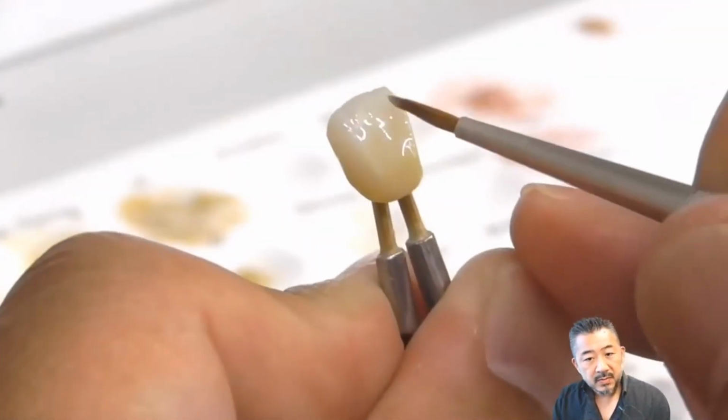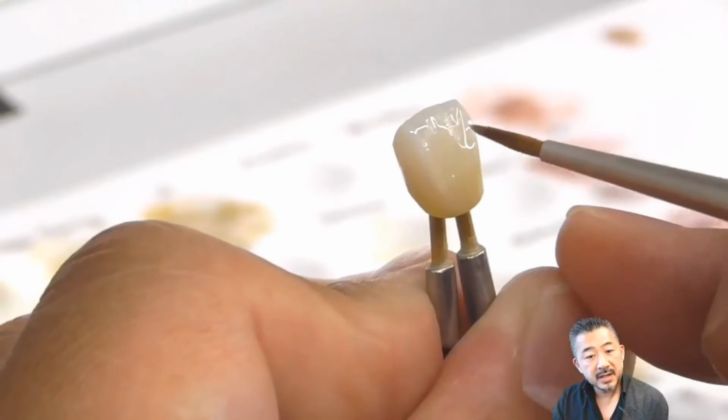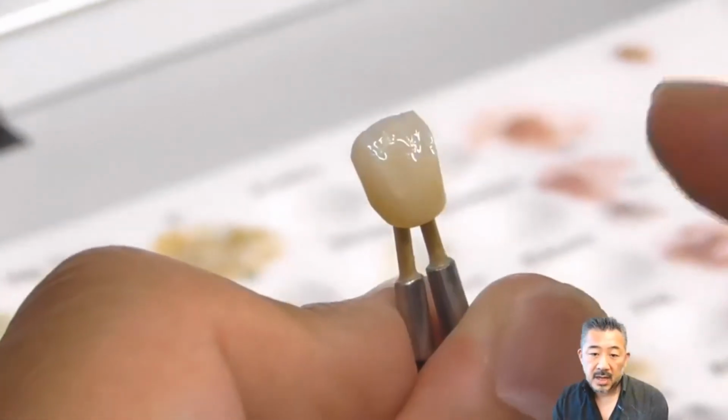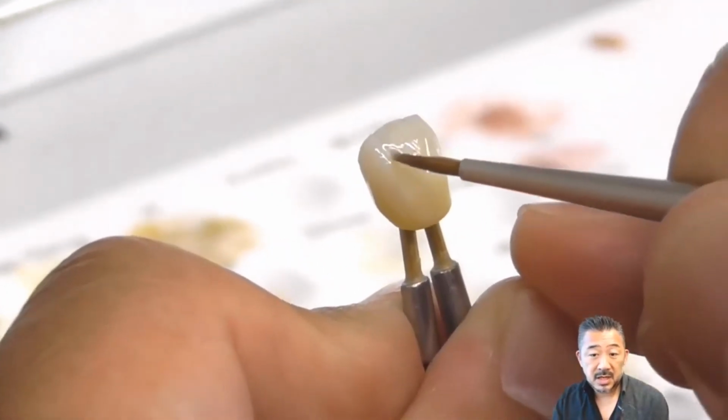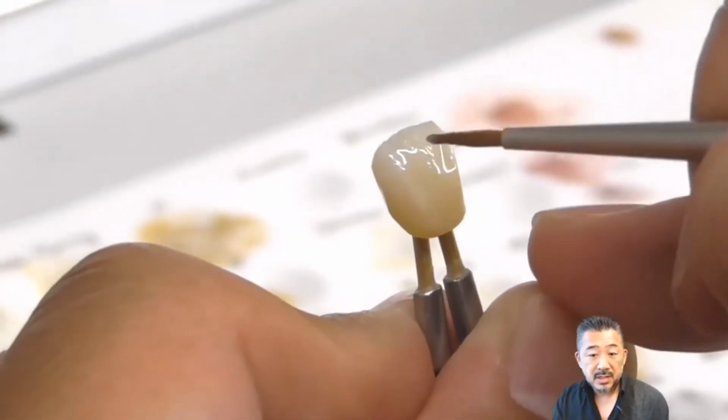If you want to emphasize the transparency around the incisor more, apply a purple paste. But if you don't need it, you can use only glaze paste. I don't use the purple paste here.